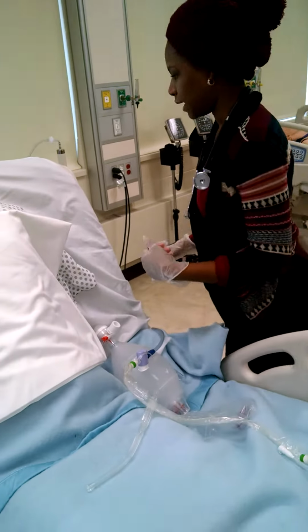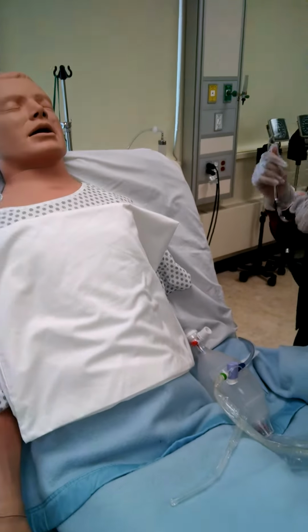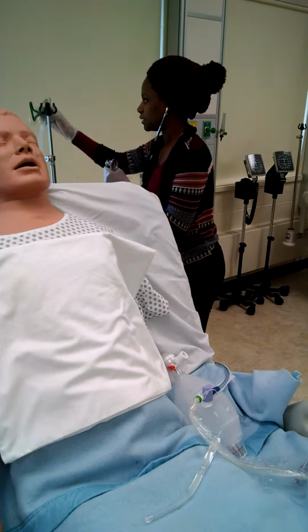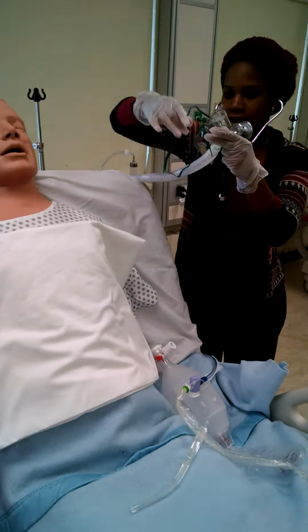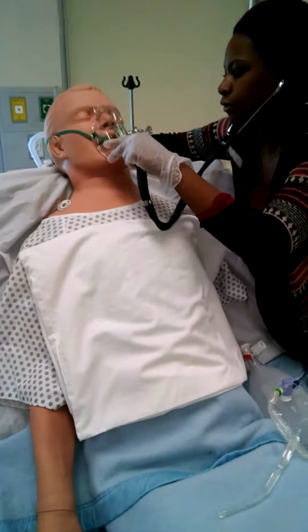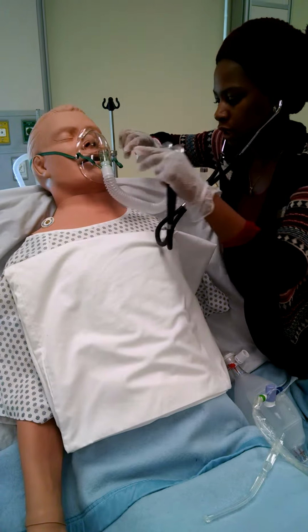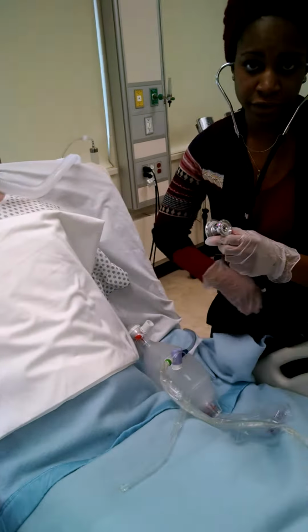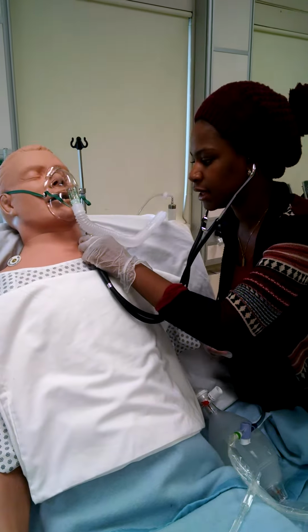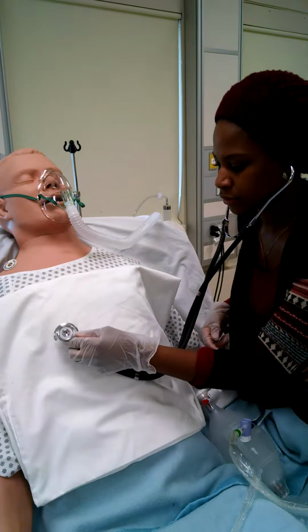At this point, I will go ahead and check for stridor and put on his mask so that he can get some oxygen. And I would have it set at the FiO2 that he was currently on. According to the chart, it was 40. Okay. So I'm going to go ahead and check for stridor. And as you can see, my patient is in the high Fowler's position for the whole procedure.